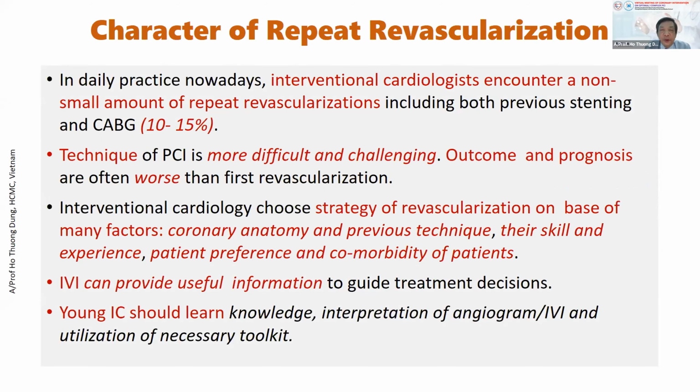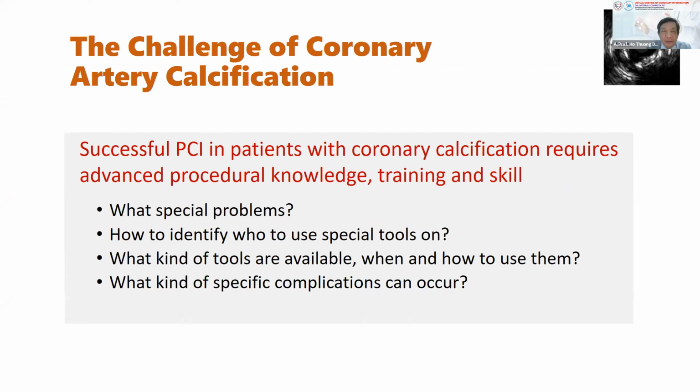And we talk about the characteristics of repeat revascularization. I won't talk about that because Dr. Duan Pinto has talked about it very clearly. But I have one case of left main PCI in combination with in-stent restenosis. And one more, the calcified lesion.